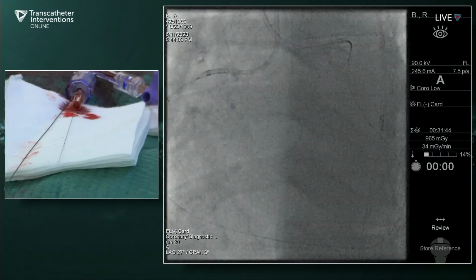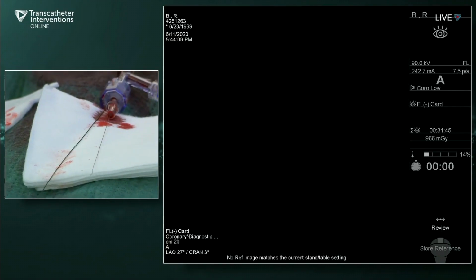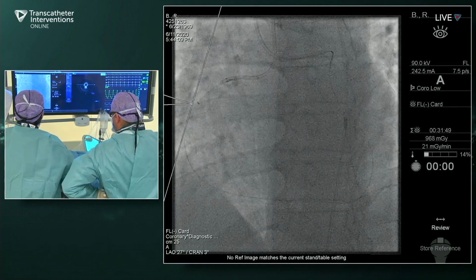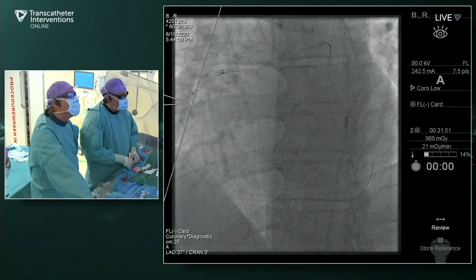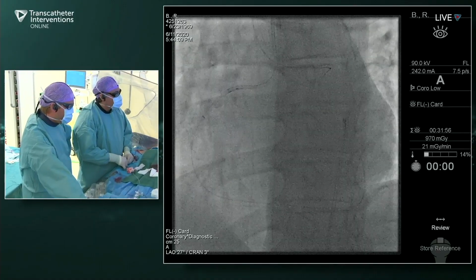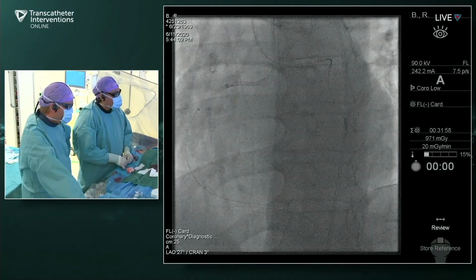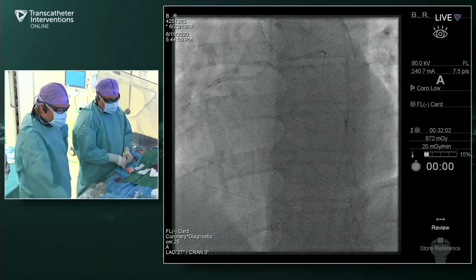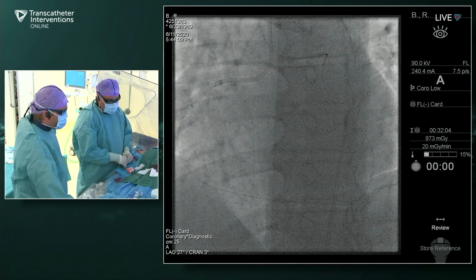I also like to check this, as it is an epicardial. You can feel sometimes the heart moving on your wire when you do externalization. So I like to have, in this specific case, some fluoro there, just to check that there is no prolapse of the guiding. One time we saw a prolapse of the guiding in the epicardial, was not nice.